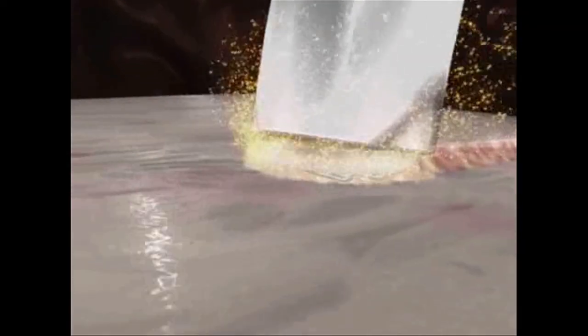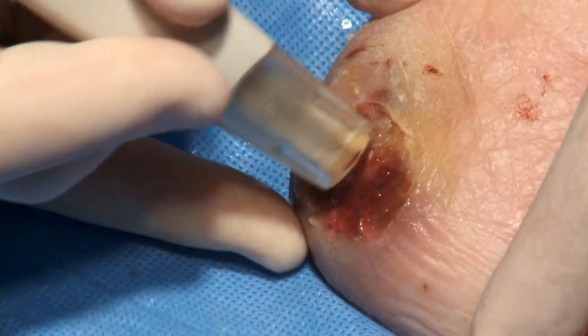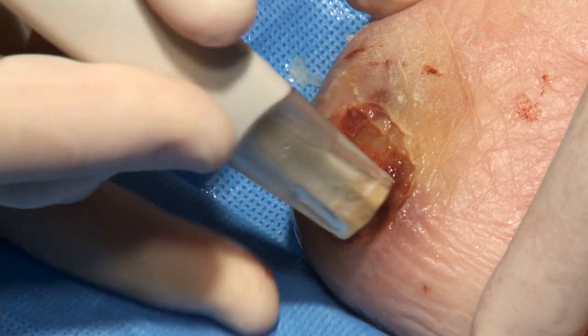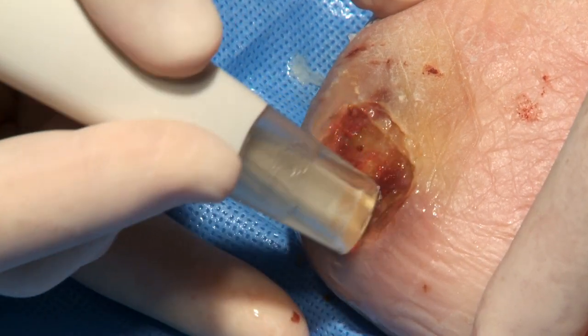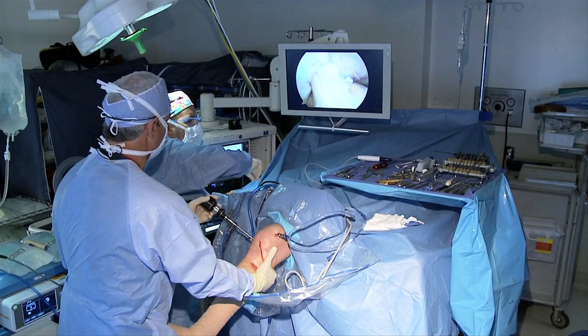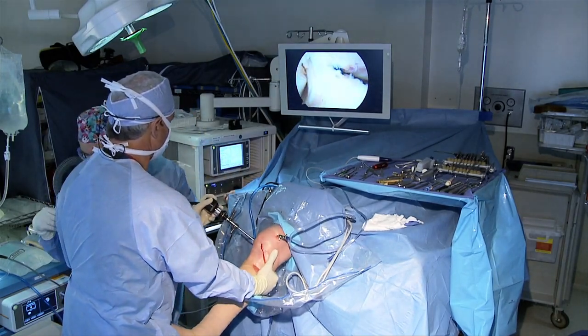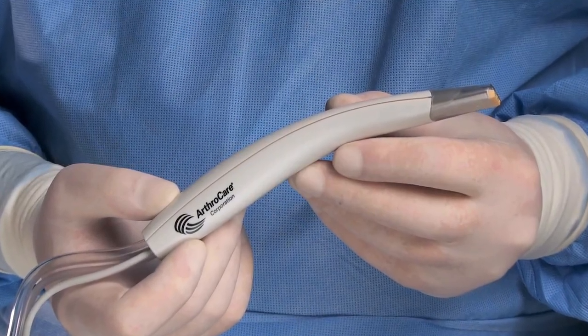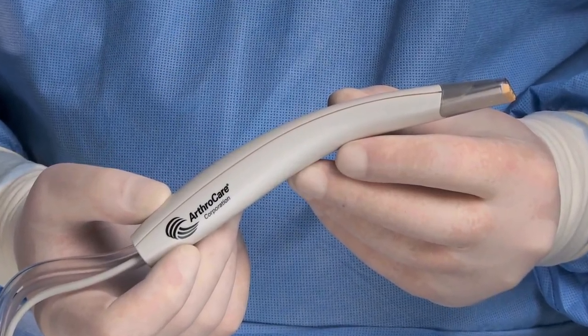The energized particles in the plasma have sufficient energy to break organic molecular bonds, excising or dissolving soft tissue by molecular disassociation. The unique properties of Coblation technology facilitate precise tissue removal while preserving the integrity of surrounding healthy tissue. Widely used in sports medicine and otolaryngology procedures, Coblation technology is finally available for wound debridement.